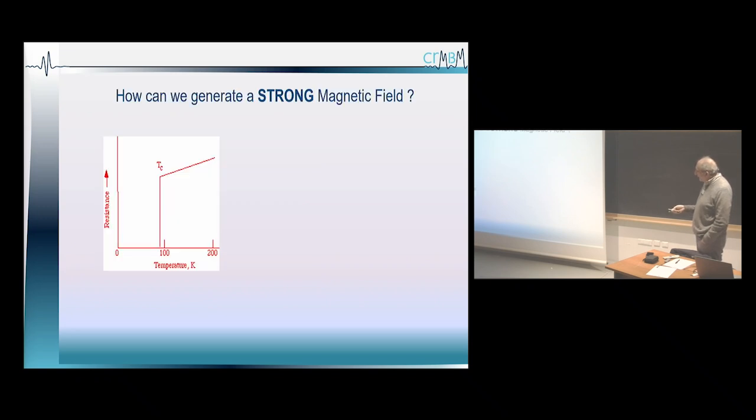So you can see in here the resistance at a given temperature. I forgot to say that you will lose the resistance if you put this kind of metal at very low temperature. Very low means a temperature close to absolute zero. If you are able to do it, you will take the resistance to zero, and then you will be able to produce a very high magnetic field.